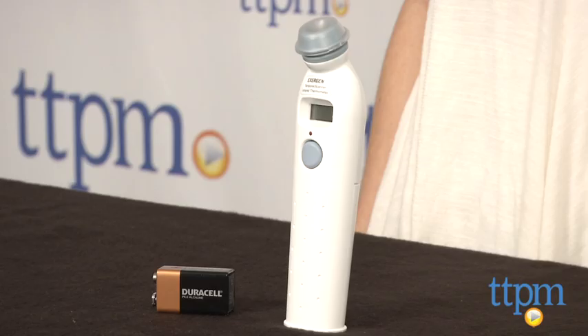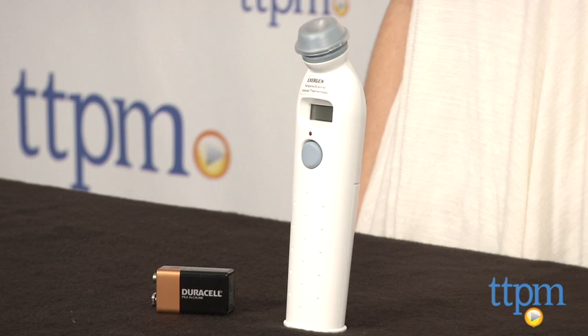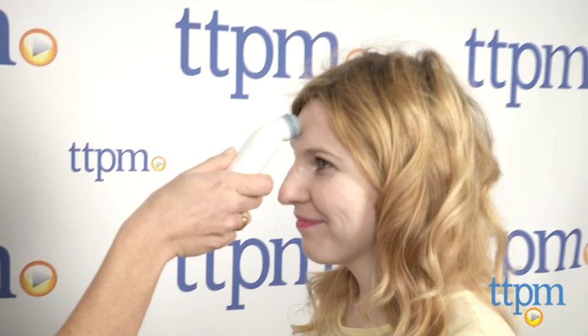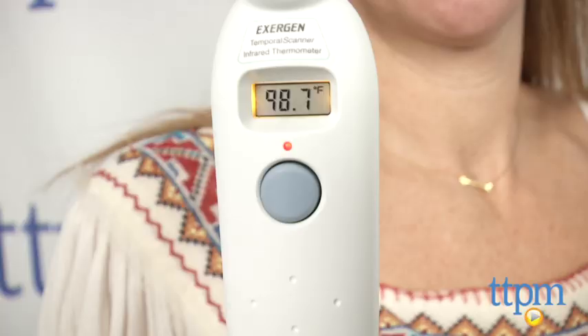It includes one 9-volt battery. To use it, remove the protective cap and press the probe flat on the center of the forehead. Press and hold the scan button and slide the thermometer across the forehead to the hairline. Once you're there, release the scan button and remove the thermometer to read the measurement.